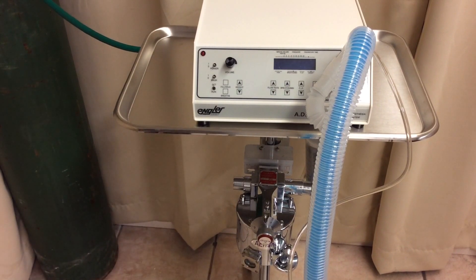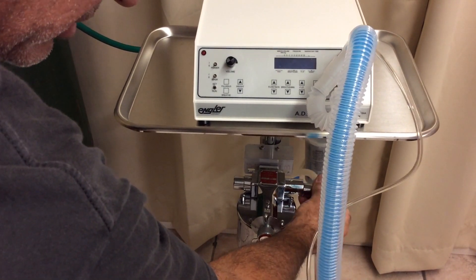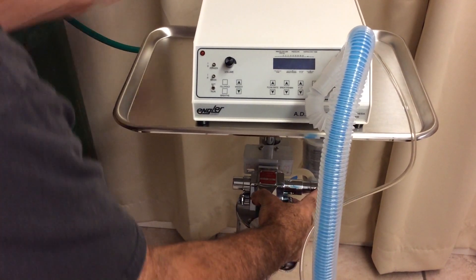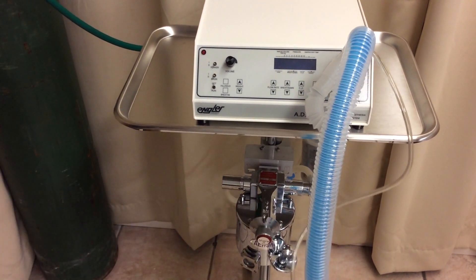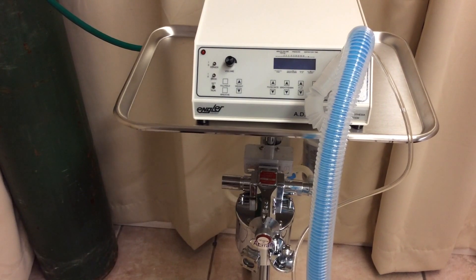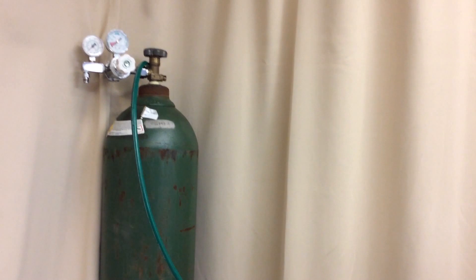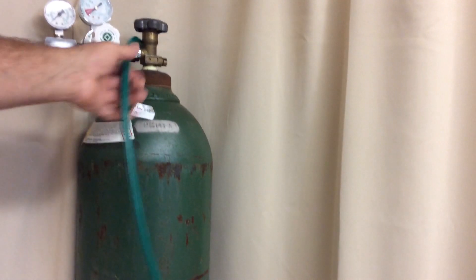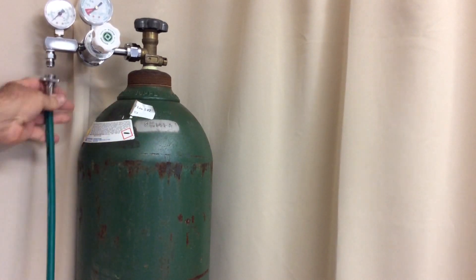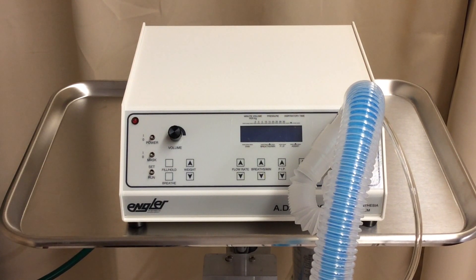Connecting the rest of the ADS is just as simple. Here we have the to and from vaporizer hoses — that connects here, and that connects here. Simple as that. Oxygen connects here. We have just done everything we need to do to set up the ADS-2000.